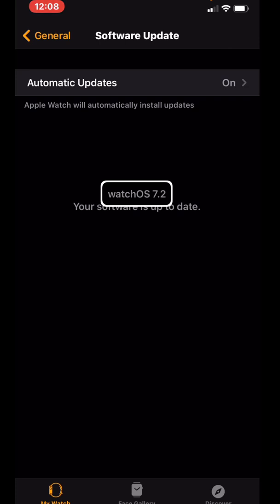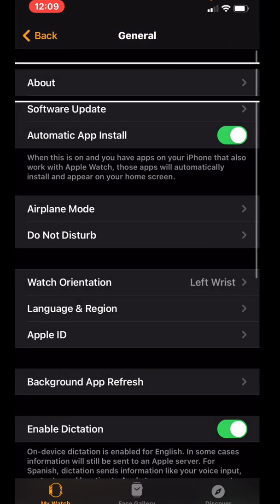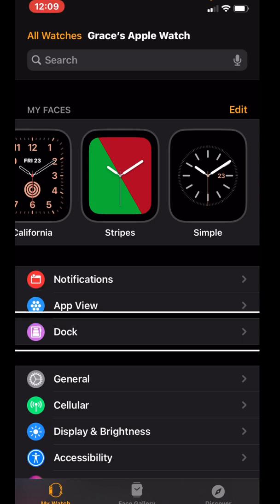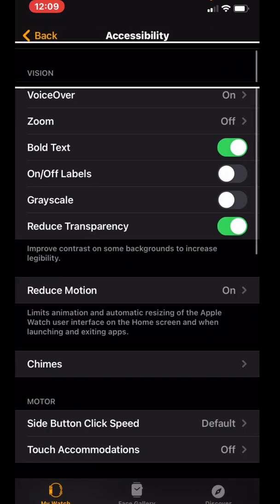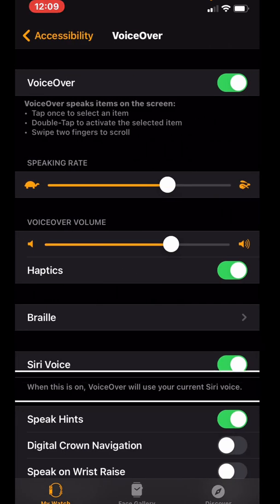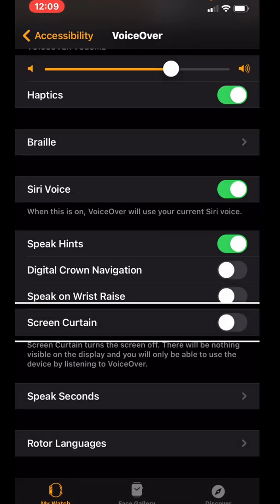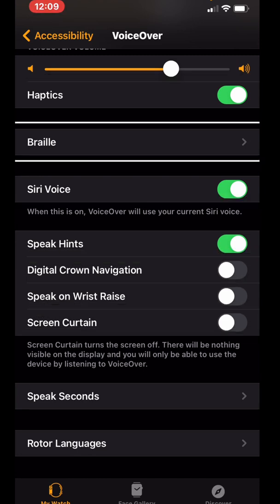After that, go back and flick until you hear Accessibility, then double tap on it. Flick to VoiceOver and double tap on that. Leave VoiceOver on. Then flick until you hear Braille — it's after Haptics — and double tap on that.